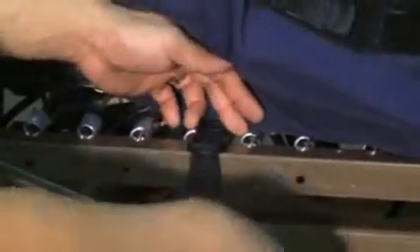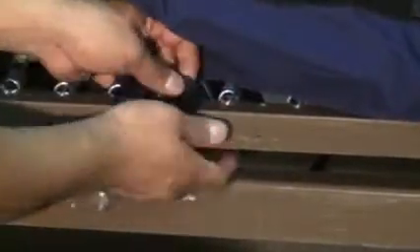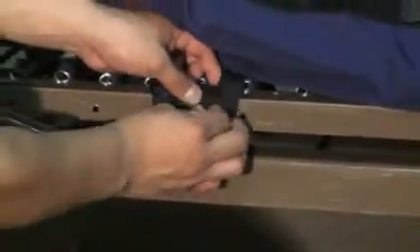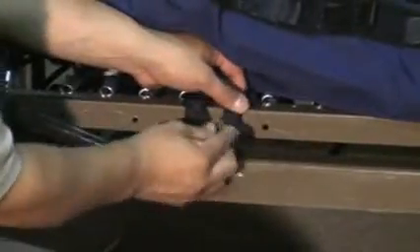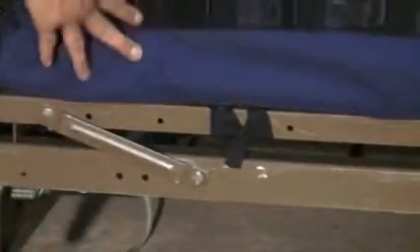Any excess strap you can simply wrap around the bed deck in order to ensure that it does not hang down freely. This same action will be needed on all four corners in order to secure your low air loss mattress to your bed deck.